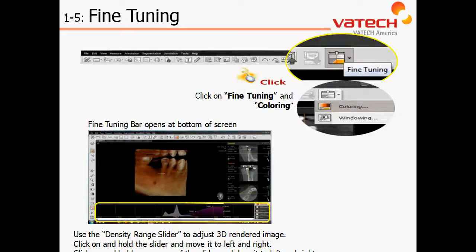At this time, I would encourage you to pause the video and go to the 3D software to replicate the steps of the fine-tuning function to segment out based on density, color, as well as opacity.